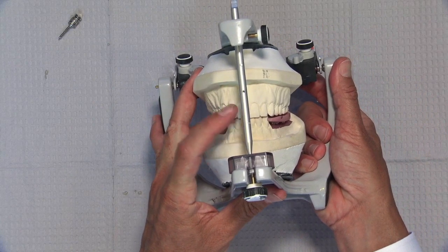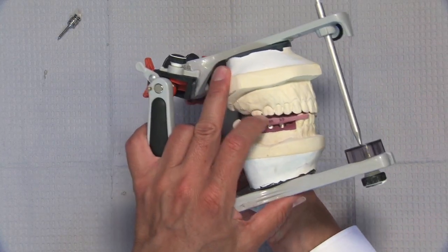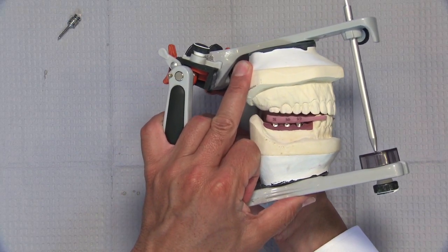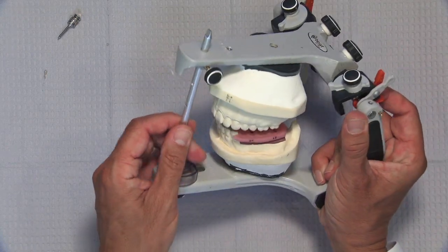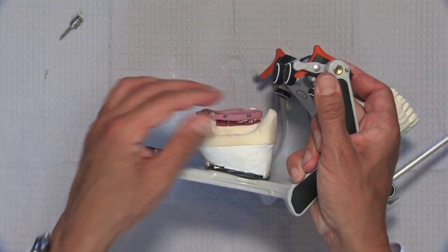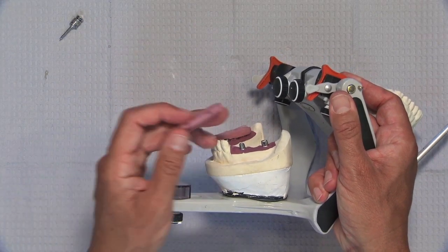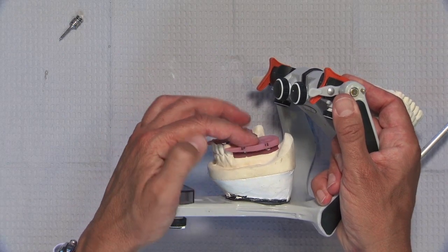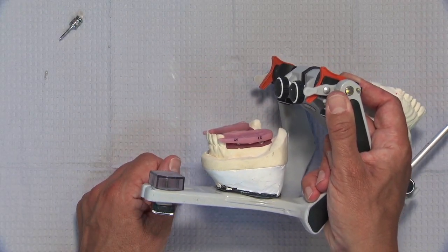Again, make sure that these anterior teeth are contacting in their proper positions with the two bite indexes in place so that the patient is coming together the right way now, because in just a minute we're going to flow our bite registration material in there. So again, it's a great use in conjunction with the custom abutments. Now, if you were using stock abutments here, you wouldn't have something like this. You could fabricate it in your office and make something like this that would attach onto the stock abutments and take the bite the same way if you're willing to go through that.